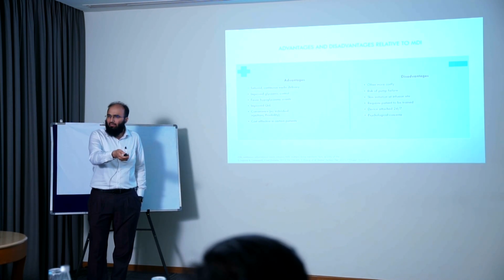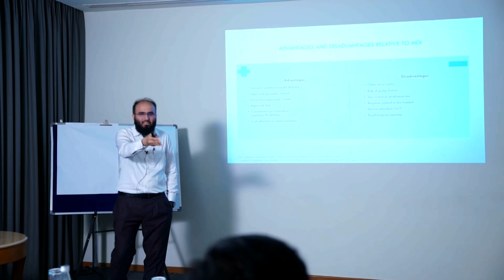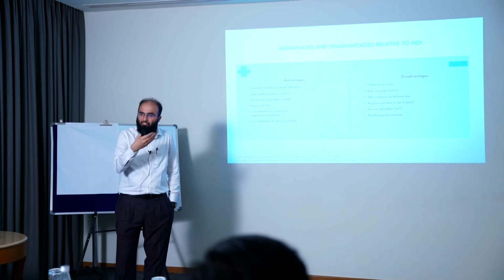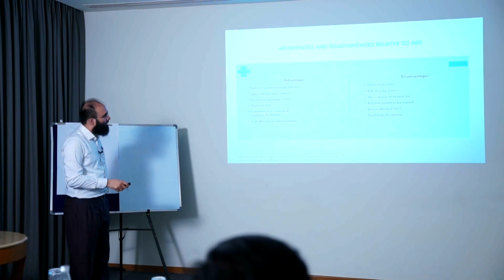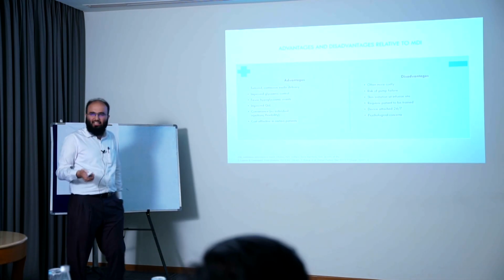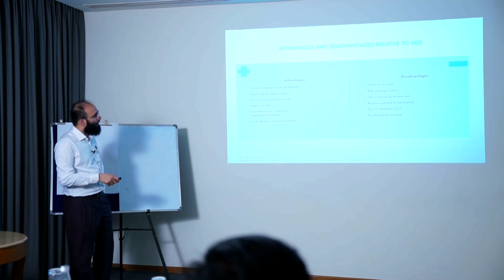Why am I saying cost effective in certain patients? Because say a type 1 diabetic, vulnerable to hyperglycemia and diabetic ketoacidosis, one admission will cost them 1.5 lakh rupees. So if you are able to put that patient on a pump, forget about the cost. Often more costly, risk of pump failure, and skin irritation at the infusion site; requires patient to be trained. And skin irritation, if he is allergic to the adhesive, then yes, you can hardly do anything about it.